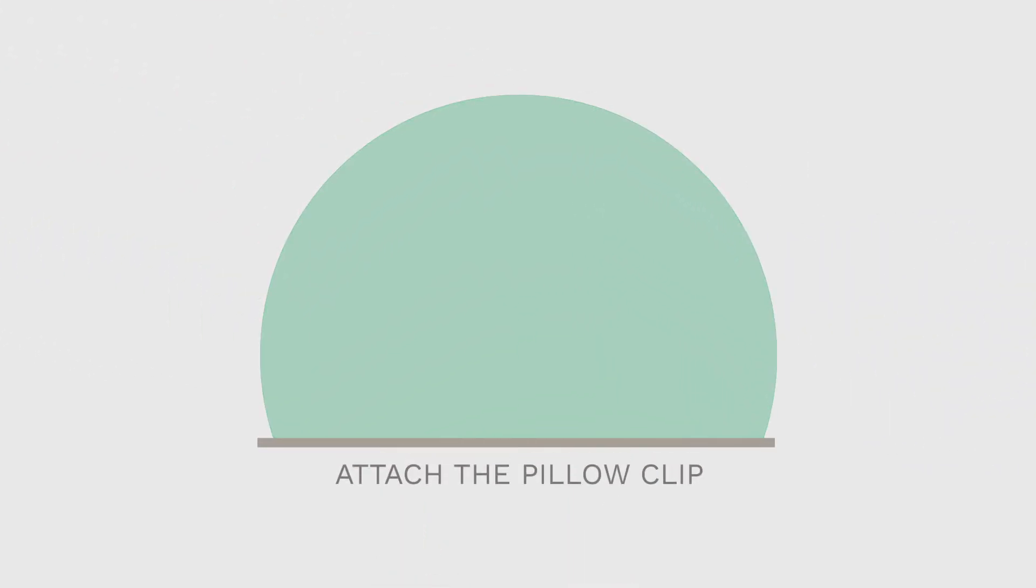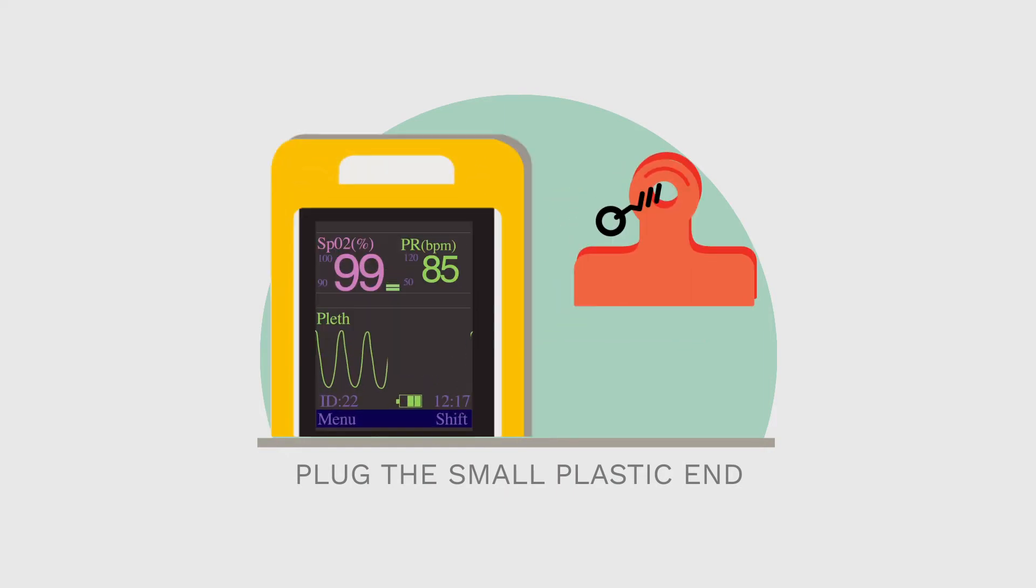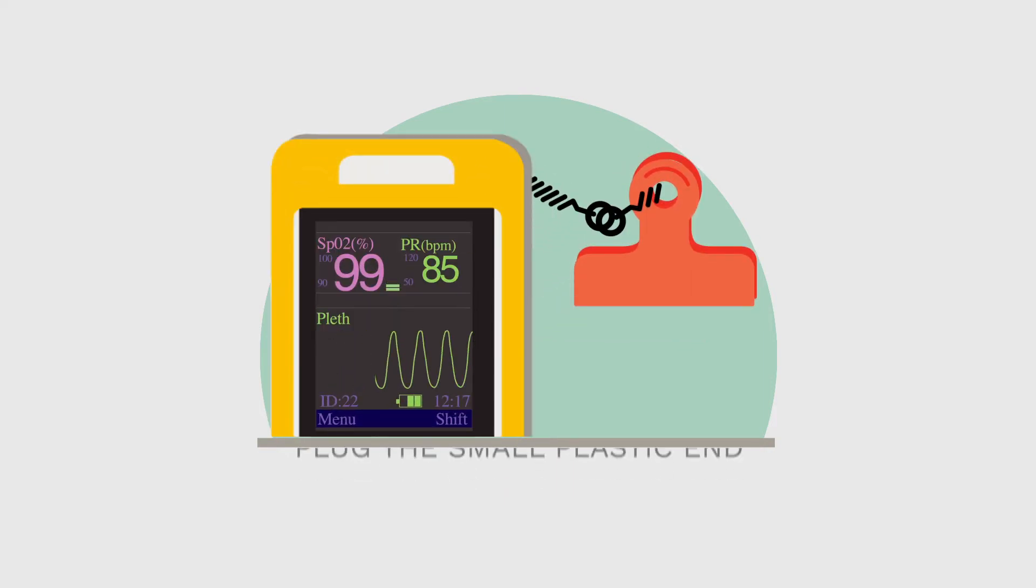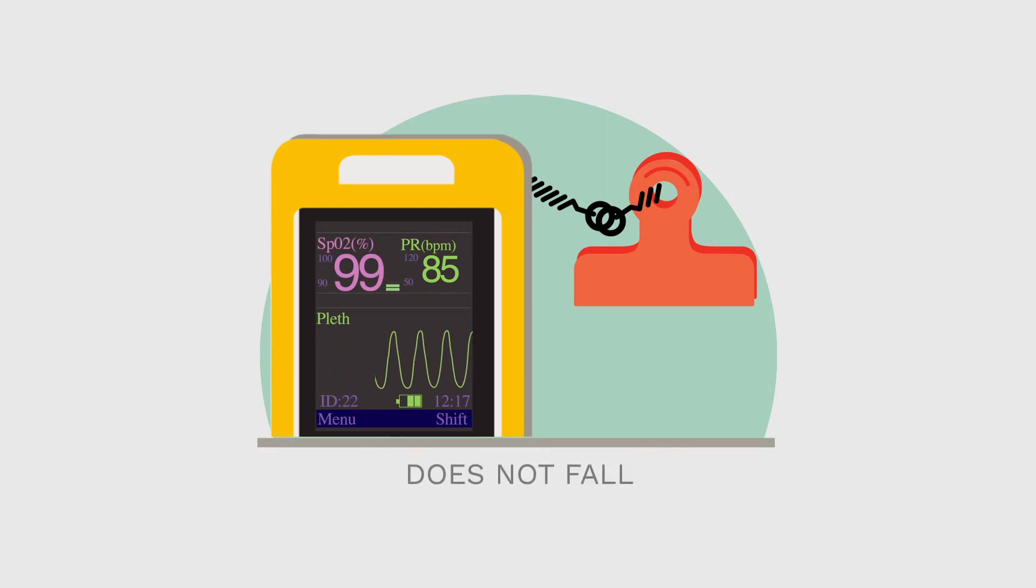Next, you can attach the pillow clip. Plug the small plastic end of the clip into the small plastic piece already attached to the top of the oximeter. This is useful for securing the oximeter so that it doesn't fall, for example during transport.